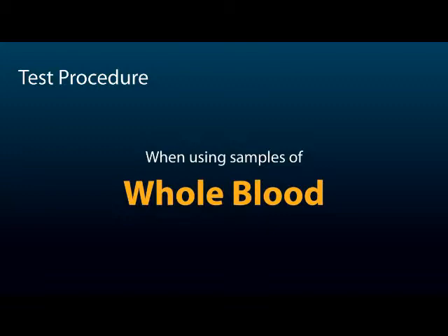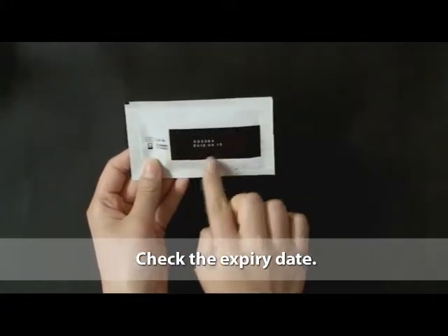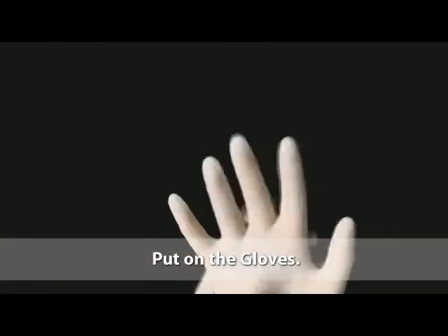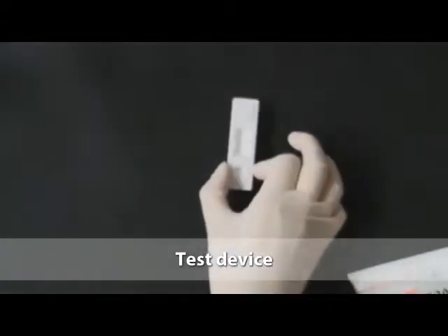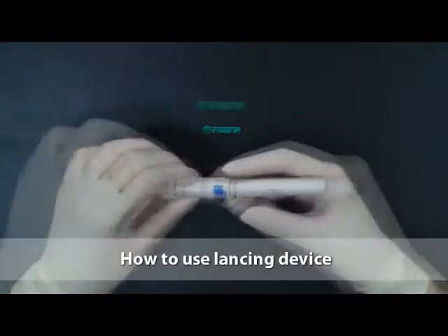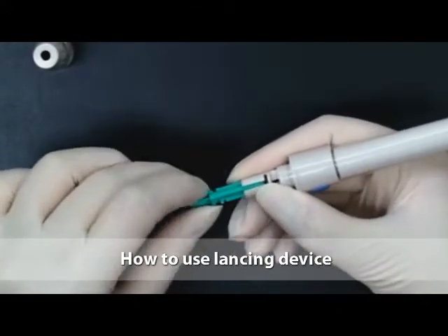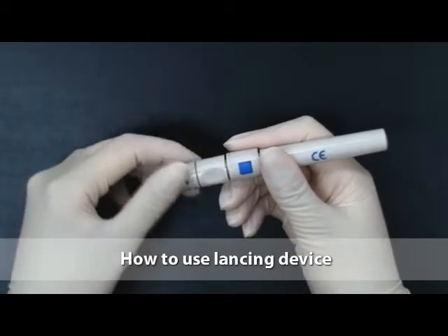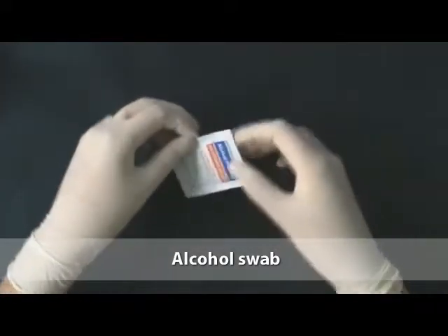When using whole blood as a specimen, check the expiry date on the back side of the test pouch; if expired, use another kit. Put on gloves — use new gloves for each patient. Open the test pouch and set the test device. Write the patient's name on the test. If you have a lancing device, assemble the lancet with the lancing device: unscrew the cap from the lancing device body, insert the lancet into the holder and push down firmly until fully seated, twist the lancet protective disc until it separates, then screw the cap back onto the lancing device body.